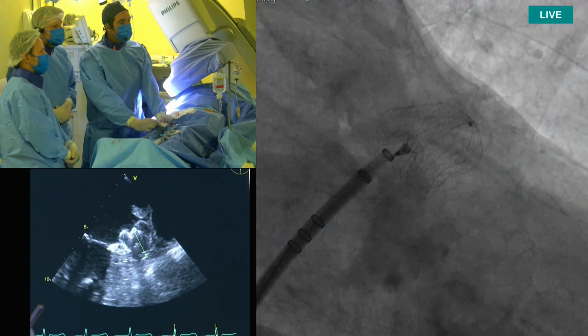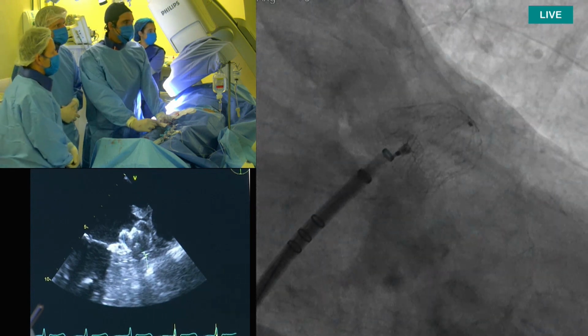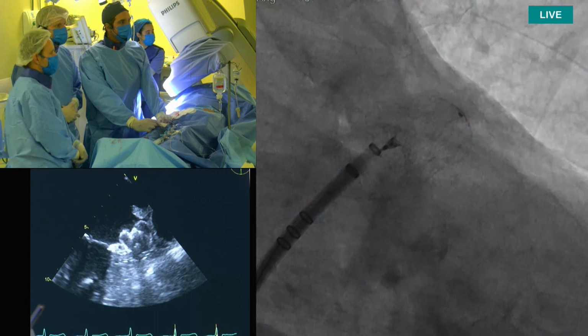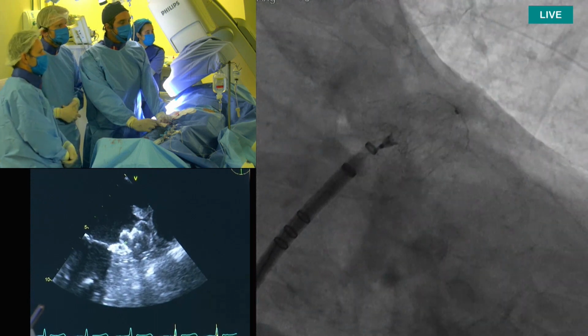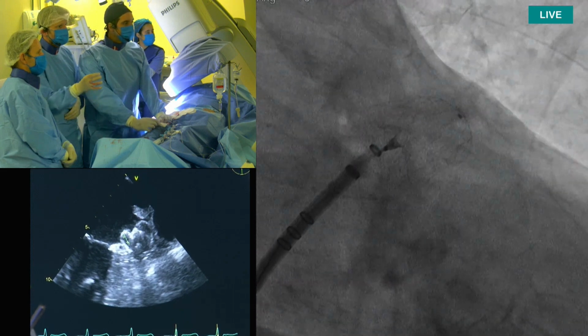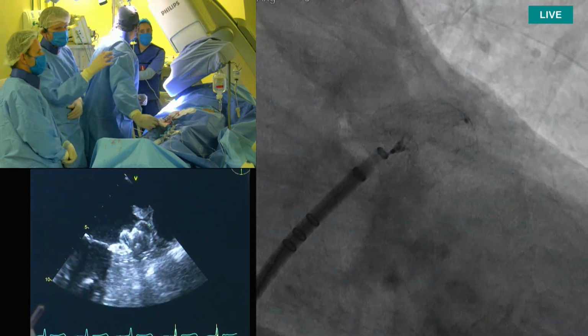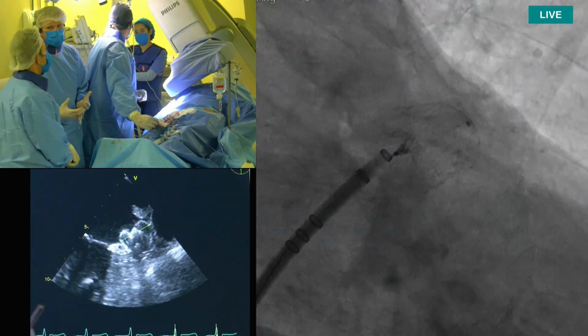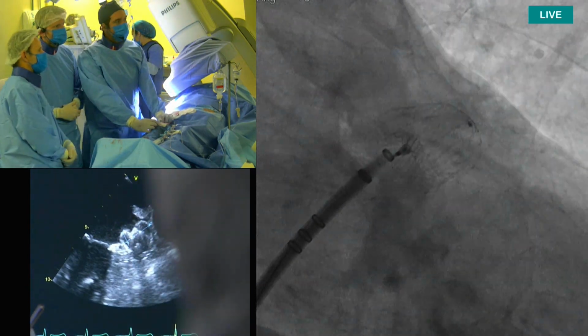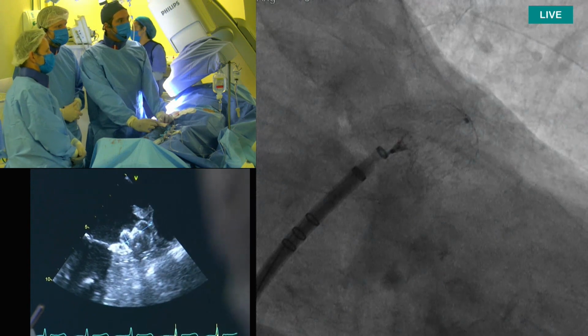I agree. I mean, I think at 35, we would be able to squeeze it in, but I'm pretty sure we would have a lot of shoulder. So, and personally, I do not like a lot of shoulder. I only accept shoulder if I know that there is a lot of trabeculation all the way up to the Coumadin Ridge. Then you have to accept it, yes? But if that's not the case, I prefer not to have a protruding shoulder, yeah.